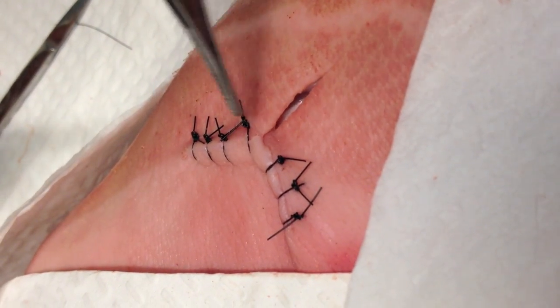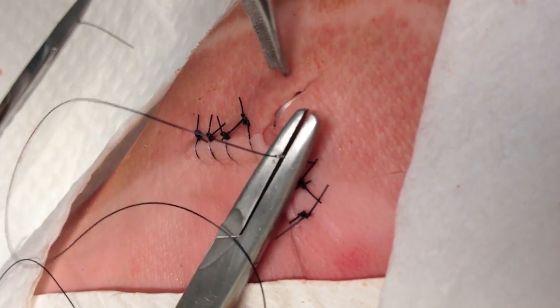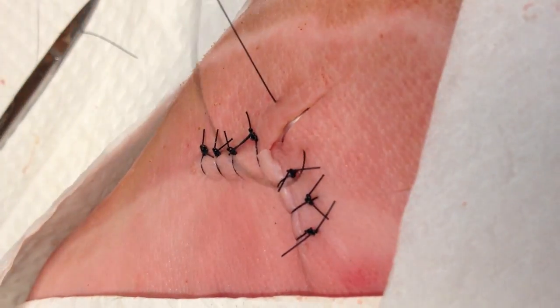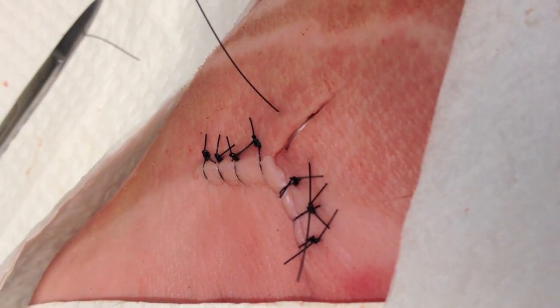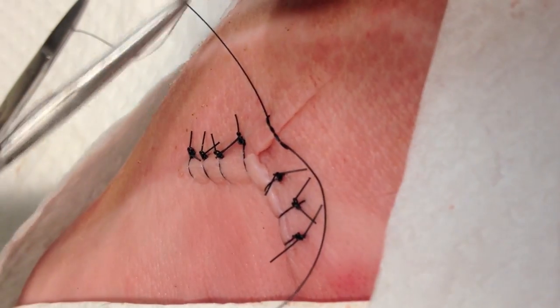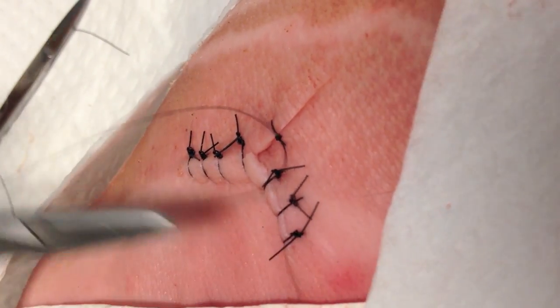This part of the video is a continuation showing the closure of the same wound. With the corner stitch in place, I've preserved the landmarks so I can close each of the different edges of the wound independently without worrying about fraying, dog ears, or landmark misalignment. I'm using simple interrupted percutaneous technique to close the different edges, and this will come together nicely using this technique.